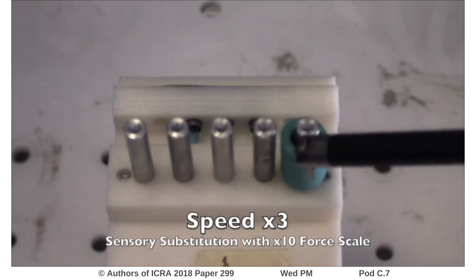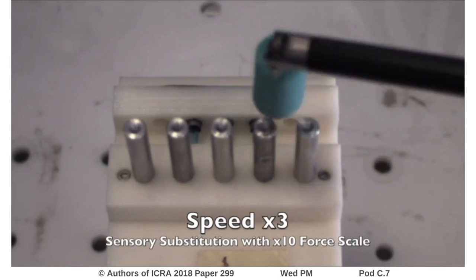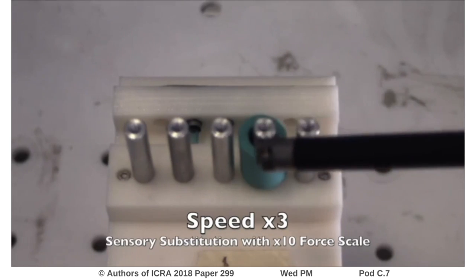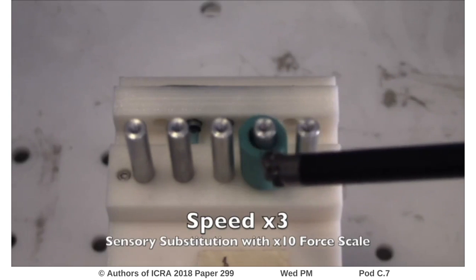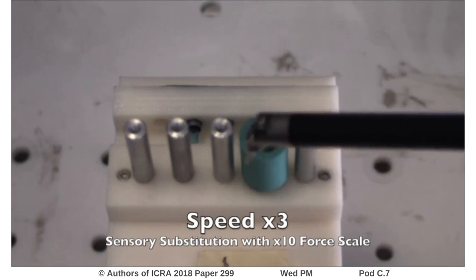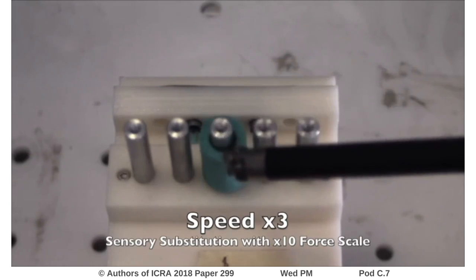This movie is an example of a step of the peg transfer task by sensory substitution with 10 times force scale. The participant shifts the soft green peg from the right end pole to each subsequent pole on the left.